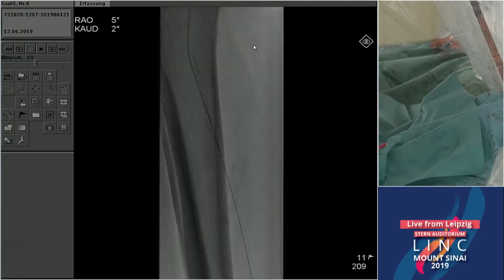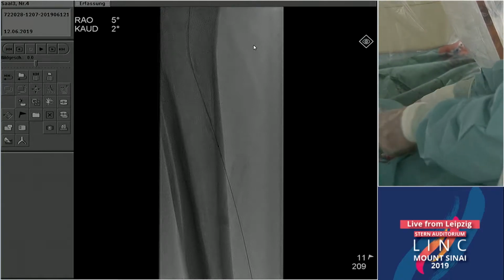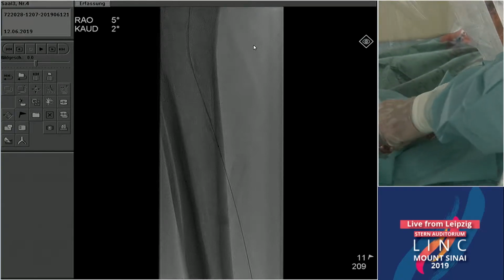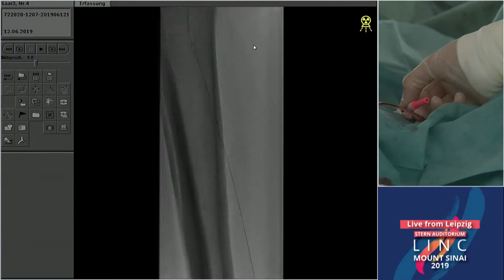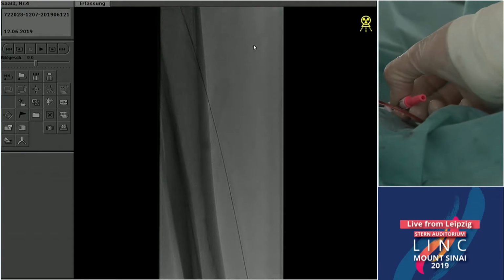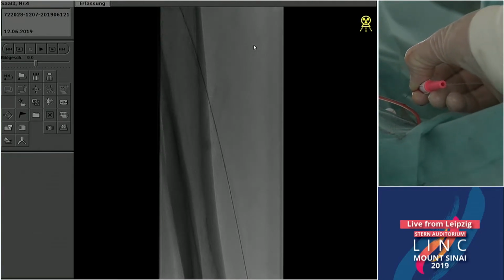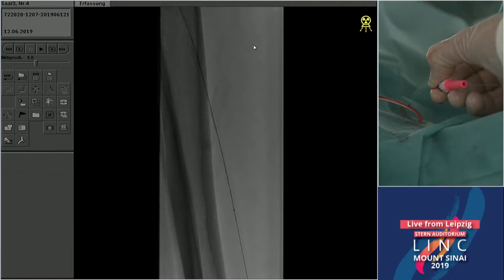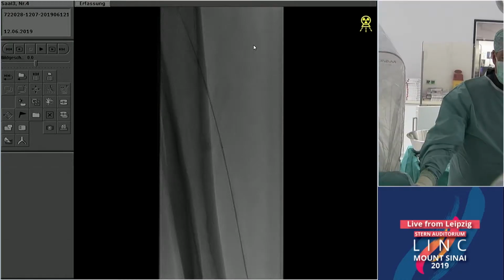Yeah. So now the AngioSculpt balloon is stuck here. And now, let me not pull. Okay, you pull. Yeah. You stop. Now we clamp the wire at the proximal end of the balloon. Matthias is now pulling the balloon inside hard. Yeah, but not so easy. But should be enough, huh?